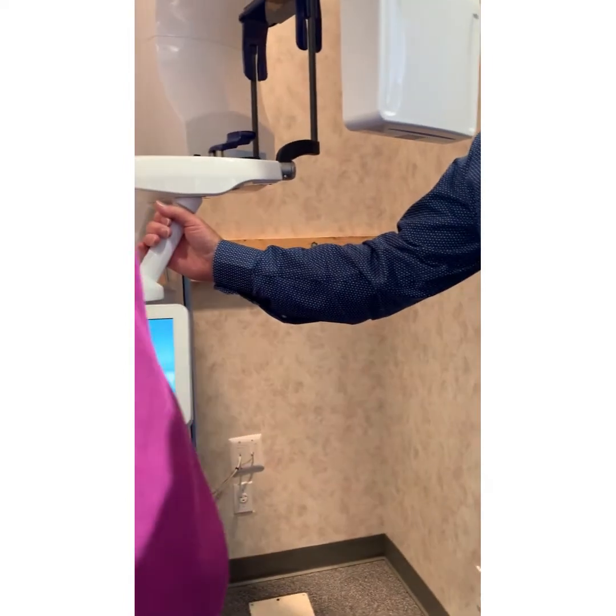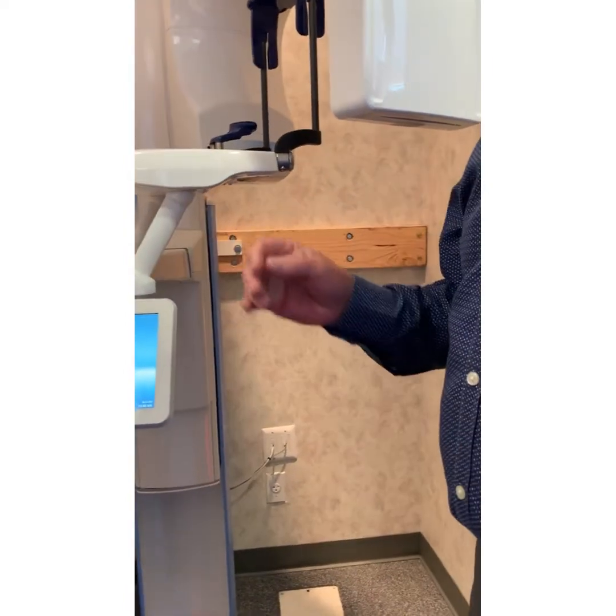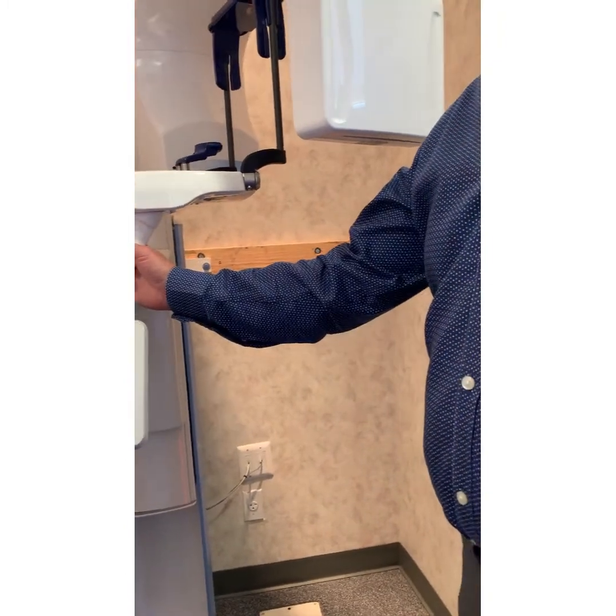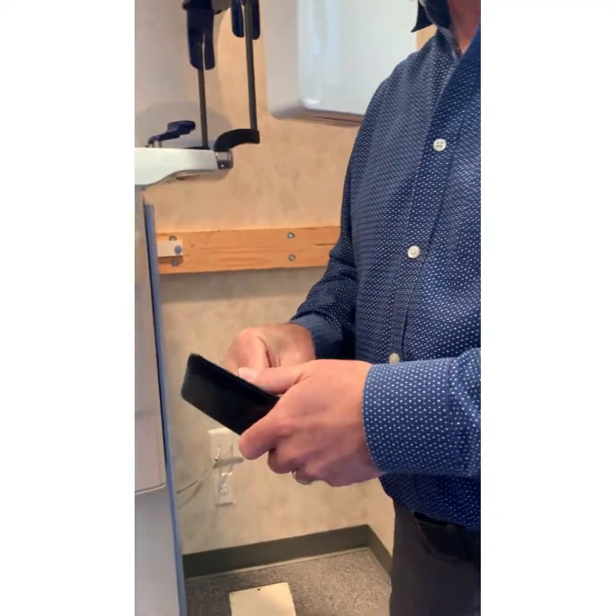All right. So is that it? For now. Great, now let's do this one more time. We're going to have one more scan here today. I want you to do this one. Because I'm more of a watch, hands-on kind of person.